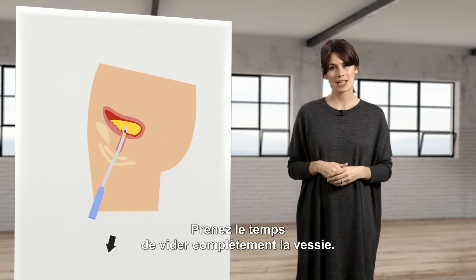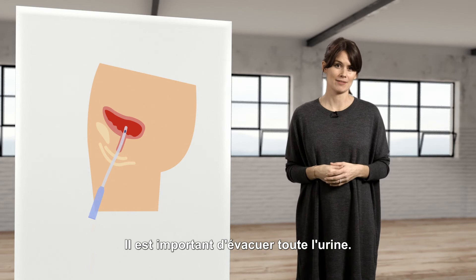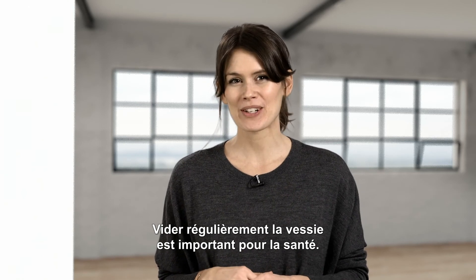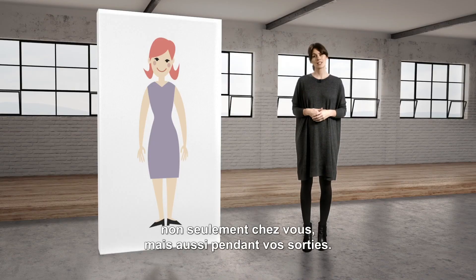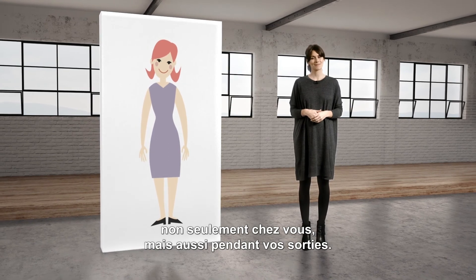Take time to completely empty your bladder — it is important to make sure that all the pee comes out. You can then throw your catheter away. Emptying your bladder regularly is an important part of staying healthy. Self-catheterization will help you and will soon be a natural part of your everyday life, not only in your home but also when you are out and about.